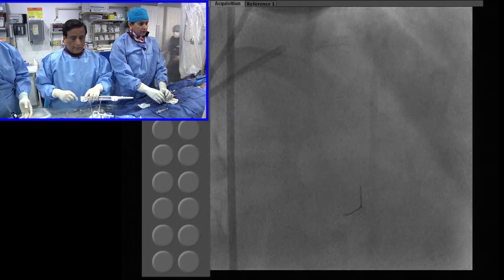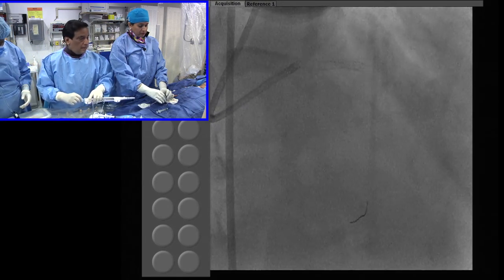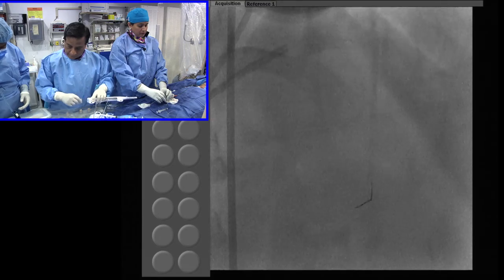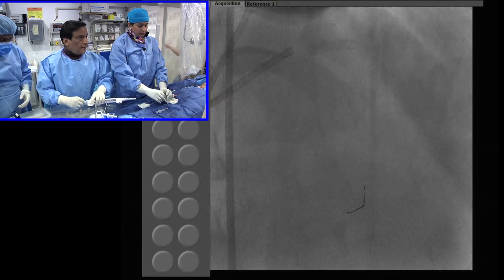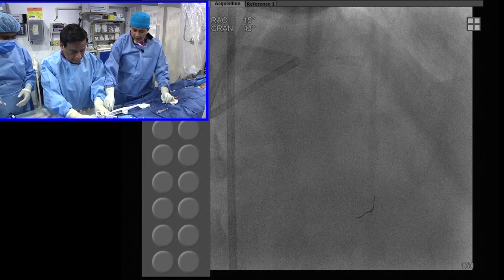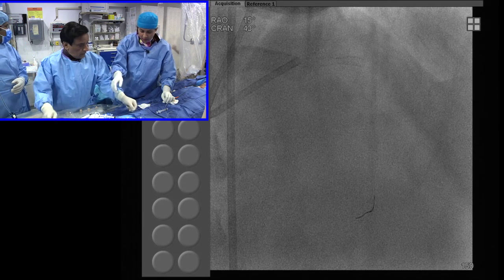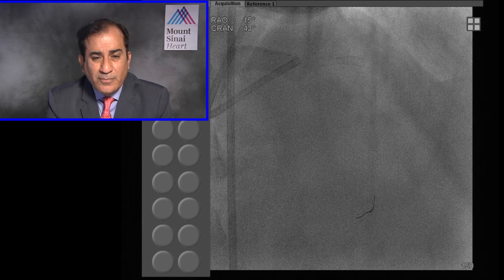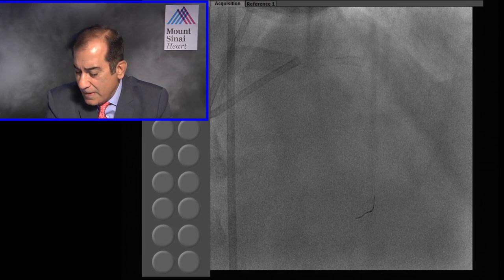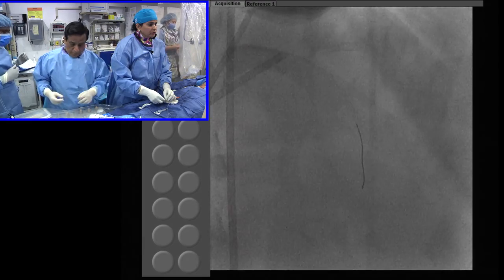Strange, we've been showing rotablator cases here, several dozens. This matter never came up. So you're downsizing to 1.5? 1.5, yeah. Okay. Anu, how much was the speed there? About 155. Okay. This is 1.75. So the two terms from what you presented, which the viewers should become familiar with, are POT and mini KBI here. Yes, exactly. Okay. So for this bifurcation lesion, definitely once we are using the BVS, very important points.